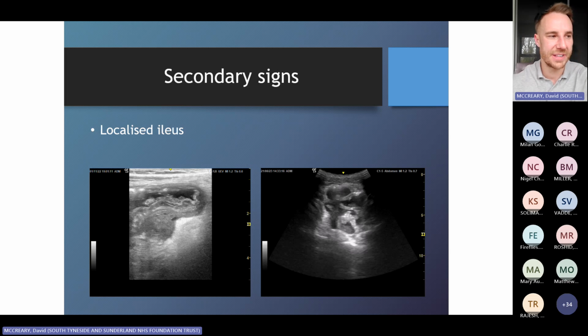So I did some face-to-face supervision with some radiologists, both of whom felt that it was probably a loop of terminal ileum or a loop of bowel adjacent. But that being said, all of this is extremely abnormal, all right? Very echogenic, in a child who had a very tender abdomen, which means that this is going to be something that needs surgical attention.